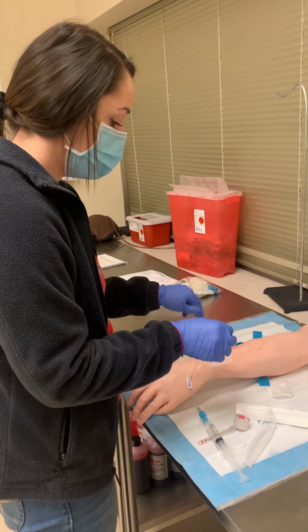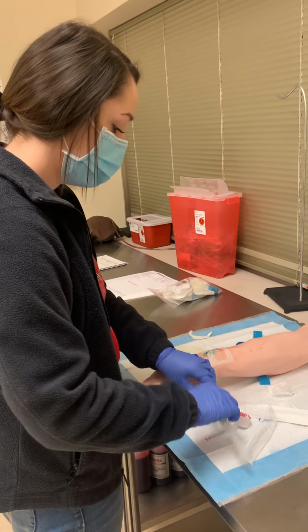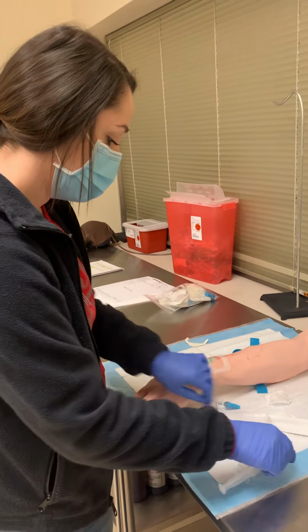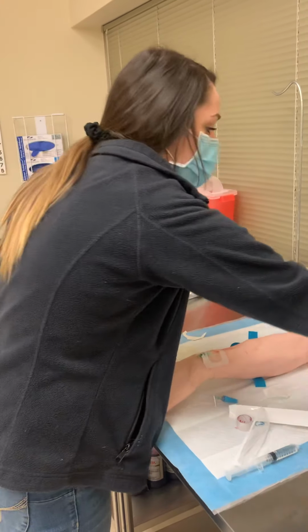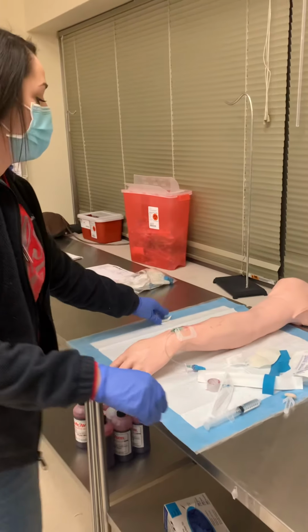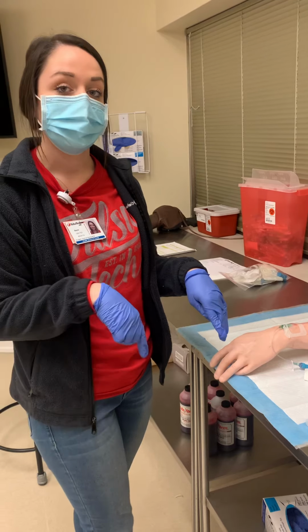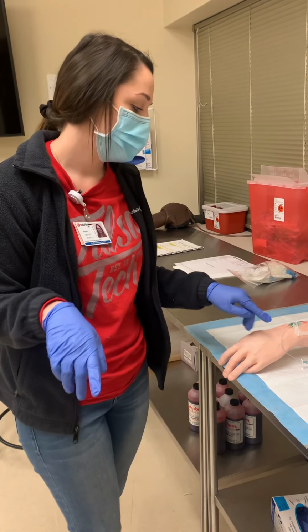I make sure to initial and date the time that I am placing the dressing. Dispose of everything in the sharps. I would clean up my equipment, put the bed in the lowest position, call light within reach, side rails up as ordered.